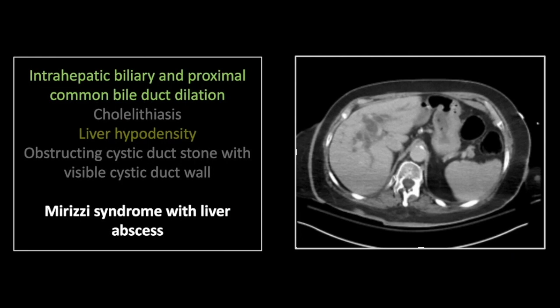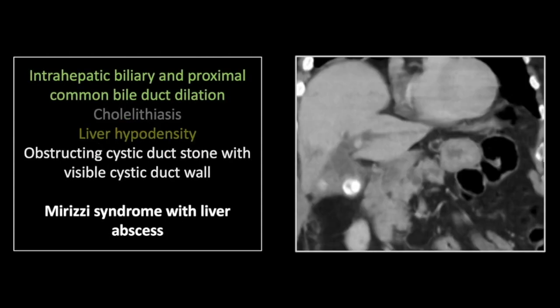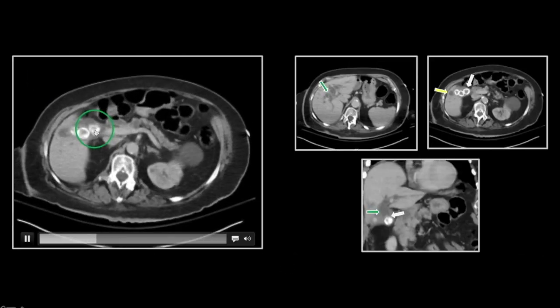Our next case is Mirizzi syndrome, where there is obstruction of the common hepatic duct by a stone in the cystic duct. There is clearly very marked dilation of the intrahepatic ductal system. In the gallbladder itself, there are multiple classic cholesterol stones — faceted, peripherally calcified. There is also an intrahepatic fluid collection consistent with cholecystitis and an intrahepatic abscess. Most importantly, there is obstruction of the common hepatic duct. You can see the dilated duct above the level of the obstructing stone.